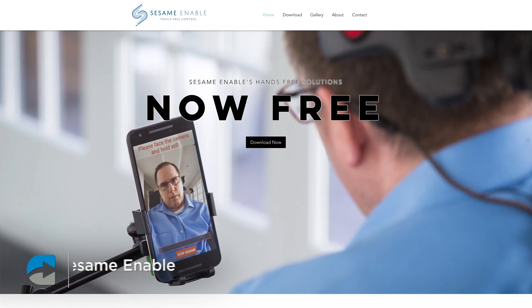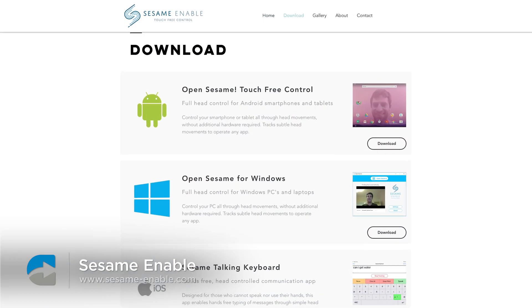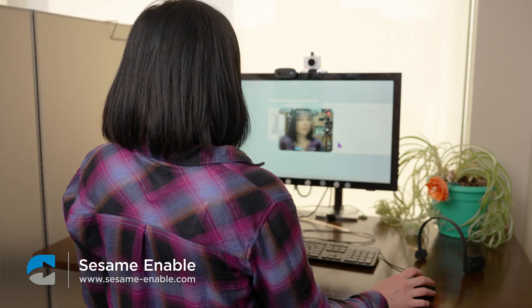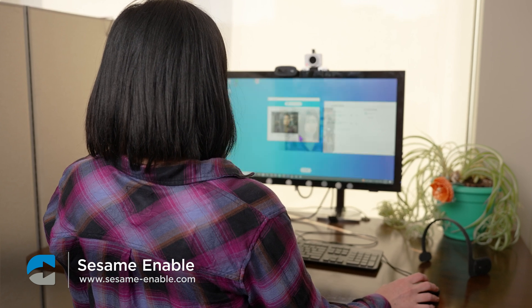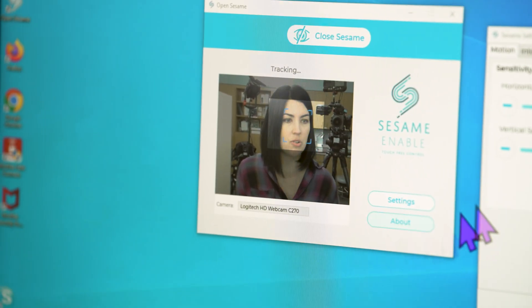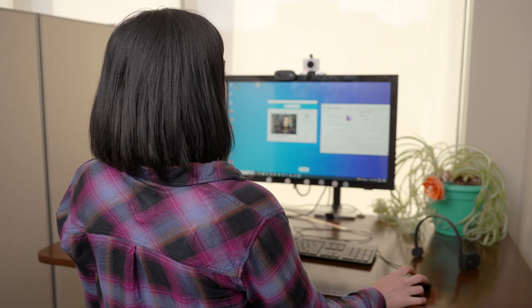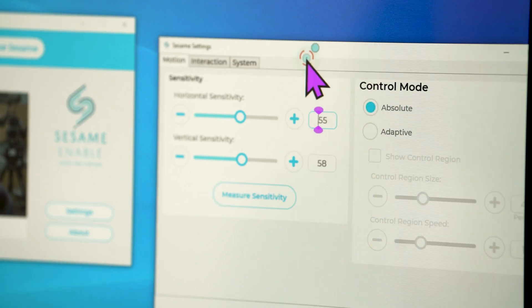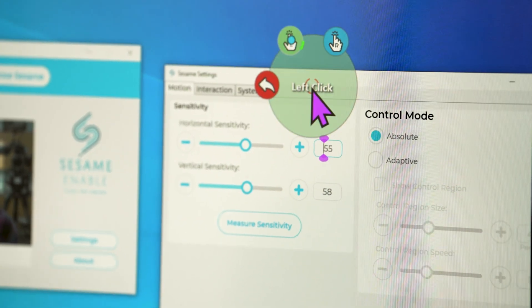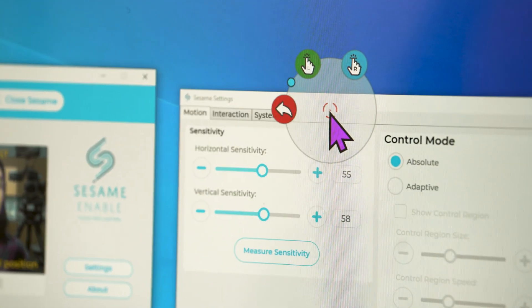I think a good place to start is with a free option. Sesame Enable is one of those options. You can download this right to your computer, and then when you start the program, it uses your webcam to read the position of your head, and then you just use movement to control it. You can also change a lot of things in terms of the way that it clicks. As I hover my head, it'll pull up a little click menu, so there I could choose right or left click, or I could exit out of that.